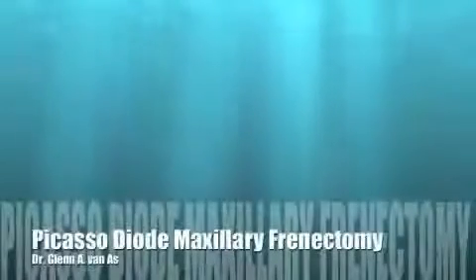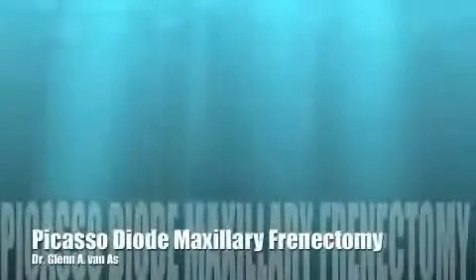In this video we are going to see how the AMD Picasso laser can be used for maxillary frenectomy. This four-year-old had a frenum that was very thick. You can see under the operating microscope at various magnifications that the frenum actually goes right between the centrals, and pulling on the frenum you'll see blanching that occurs in the diastema and the tissue in between.